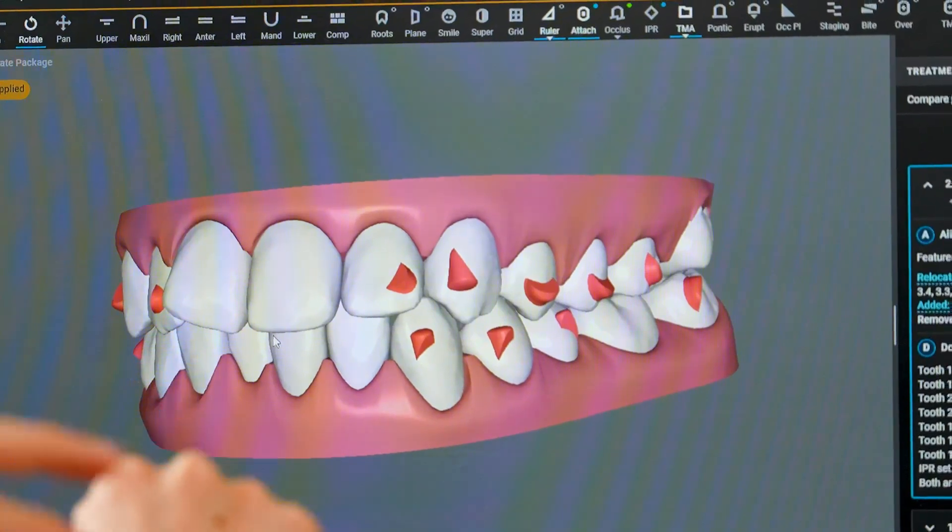With Invisalign, we have to wear it all the time for it to work. Can you see these little red? They act like anchor points, so when you wear the aligners, they have something to grab onto. We're going to create some gaps — essentially polish in between two teeth to create a space. That space is going to allow your big teeth to move backwards, to have enough room for some of your front teeth to really align and pull in.